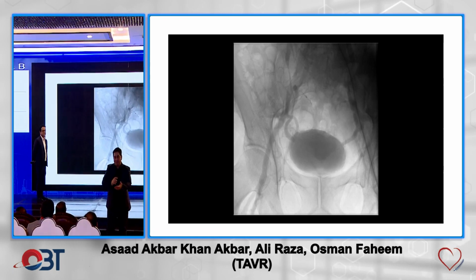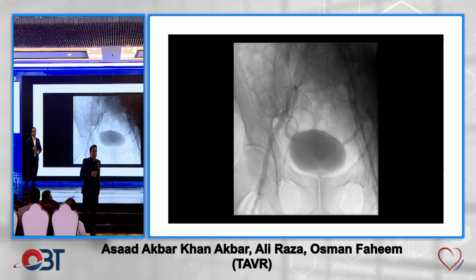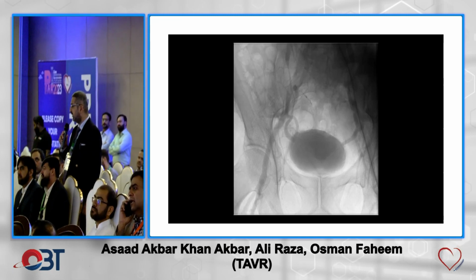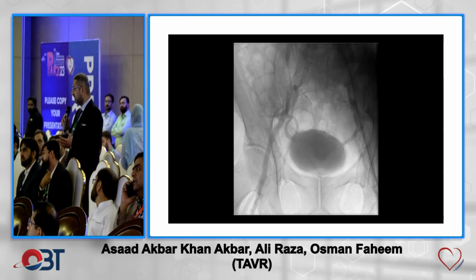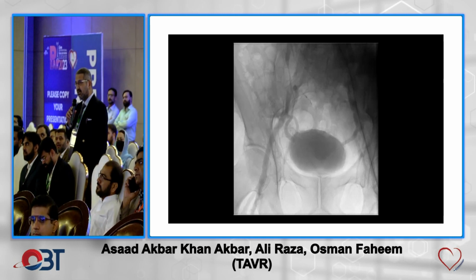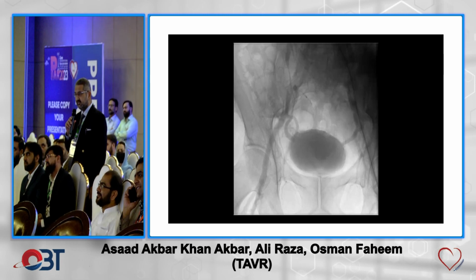I'm Dr. Atif Sher from NICVD. I want to make two comments. One is about the peripherals. It's not only about the calcium, but rather the distribution of calcium. If it's circumferential, then it definitely becomes more difficult, leading to more vascular access complications.